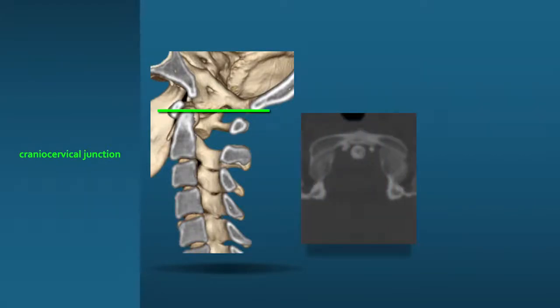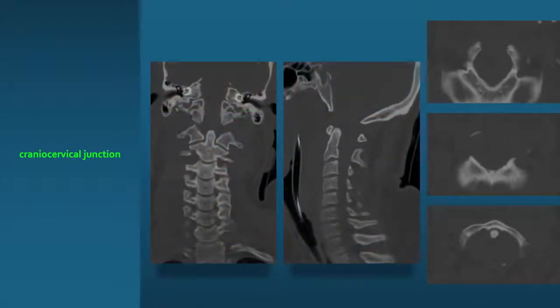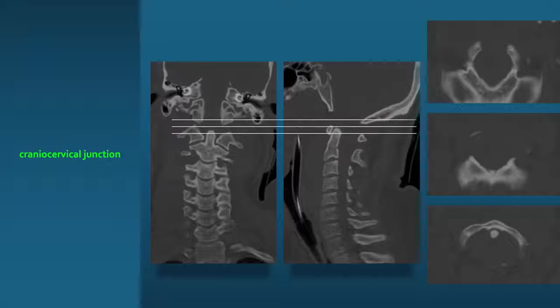So when we look at a CT slice that's at this level, the bottom of our head CTs, the top of our cervical spine CTs, you really should see three levels. You're going to see occipital condyles, you're going to see the anterior arch of C1, and you're going to see the top of the dens from C2. So when you see something that looks abnormal like this, where you've got occipital condyles, then your next slice you see nothing, and then finally you see C1 and C2 together, that's a problem. That's a patient that looks like this, where those three slices were taken at levels like this, and there is vertical distraction between the head and the cervical spine.